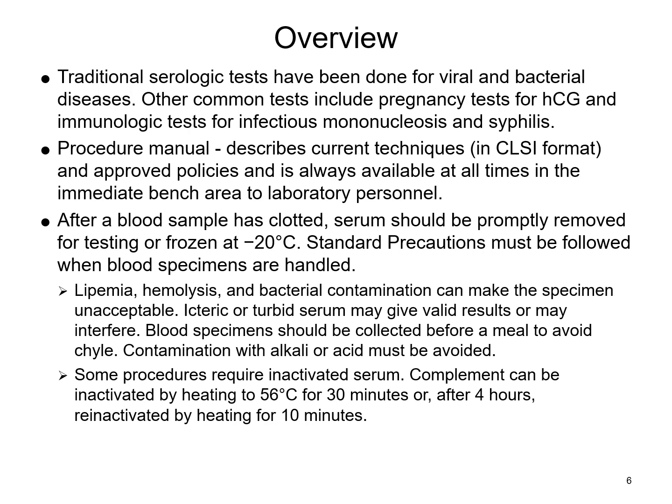Things like spinal fluids could be used, or other body fluids, swabs, exudates, discharges. Some testing looks for premature rupture of the membranes, as in a pregnant patient's water breaking early. That is an example of a swab type test where some type of discharge of fluid is submitted.